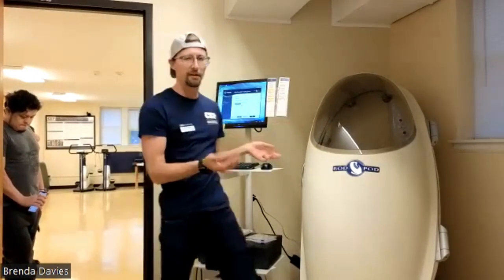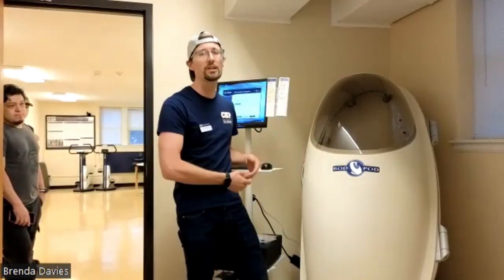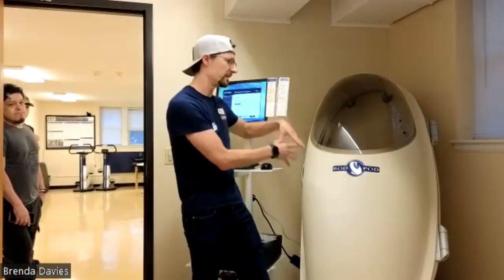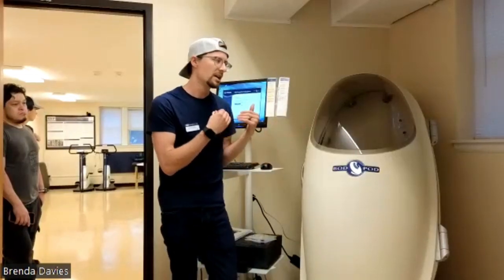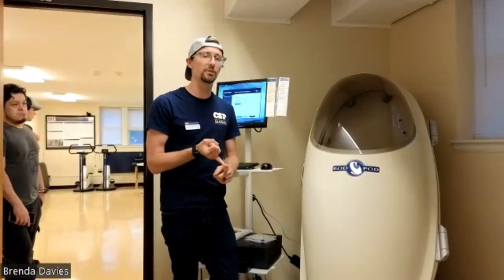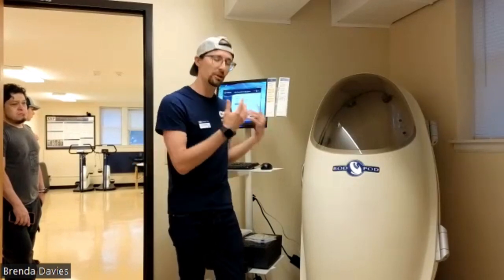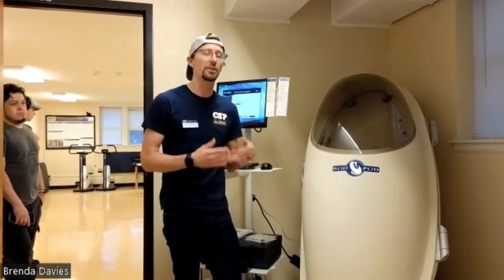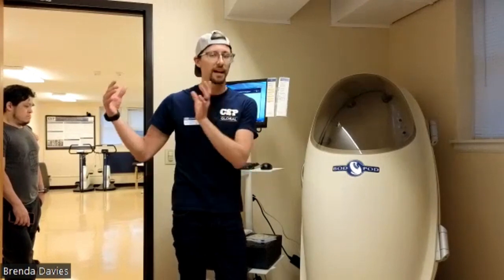If you've ever done underwater weighing or hydrostatic weighing, it's the same type of principle: Archimedes' principle of displacement of water, or in this case, displacement of air, to determine what that volume is. So we would need to know the weight of the individual and the volume of the individual to get the body density. Once we know the body density, we can then determine their body fat percentage, with the understanding that fat mass is less dense and non-fat or lean mass is more dense.